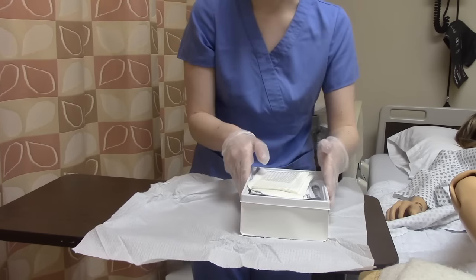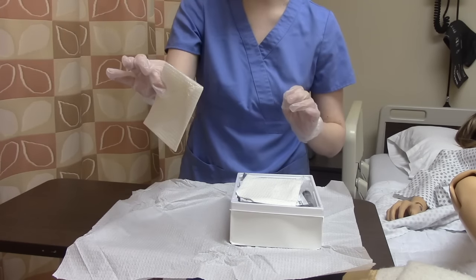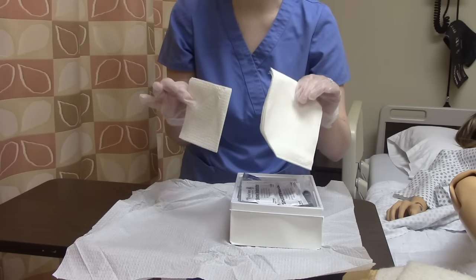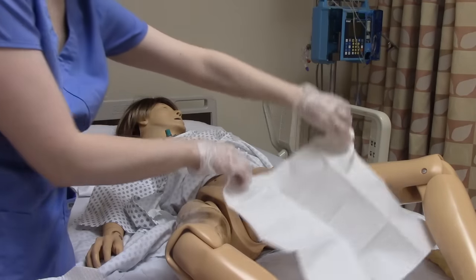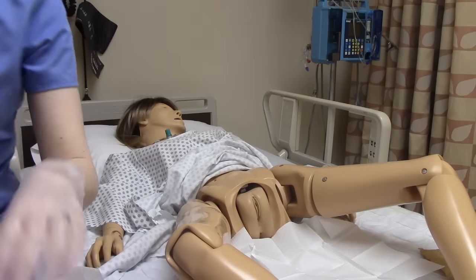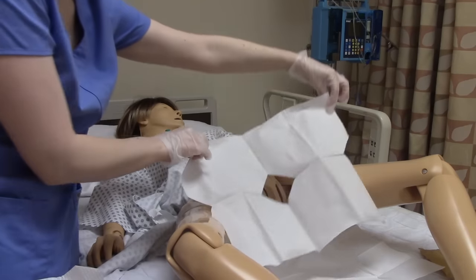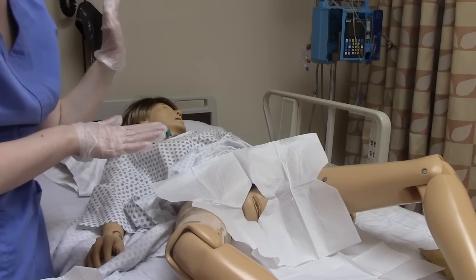Now we can prepare all of our items. The first two things we have are our drape that's going to go underneath the patient and then the one that's going to go around the patient covering their genitals, only exposing the area that we need. Shiny side down, we're going to place this down trying not to touch anything else. Then we're going to use our cover drape — it has an opening in it — and place it right here on our patient.